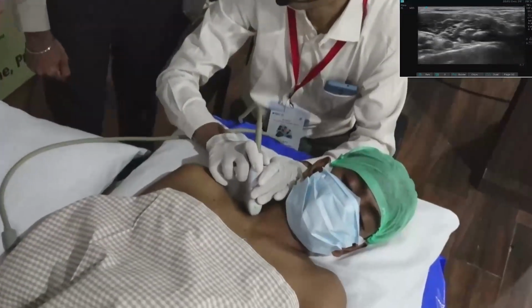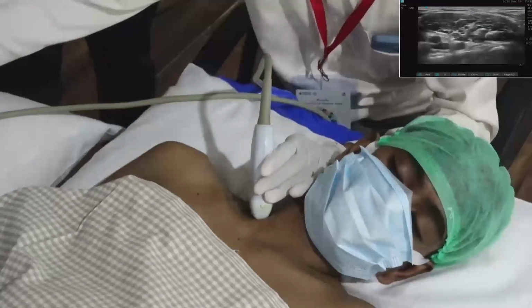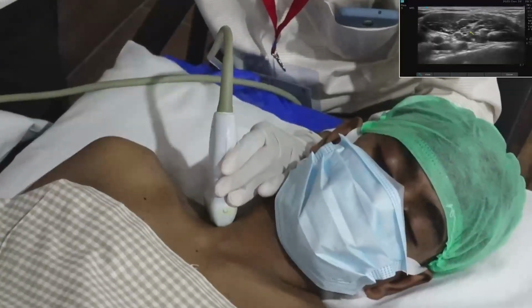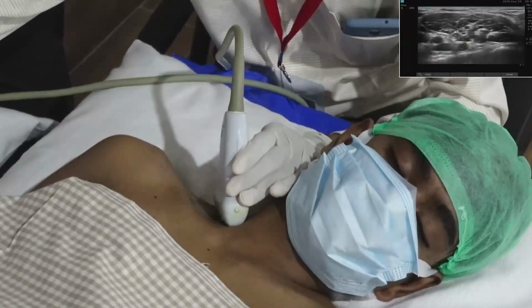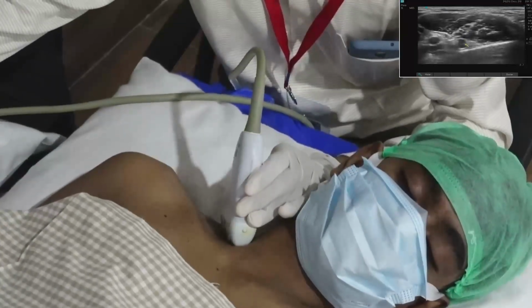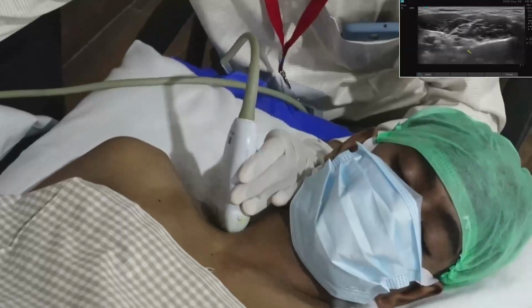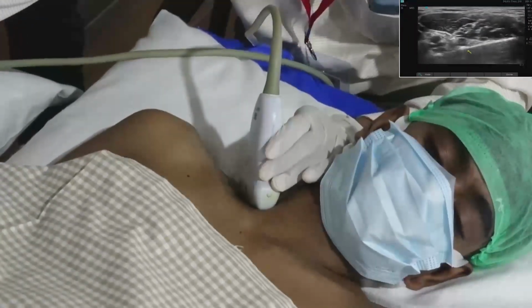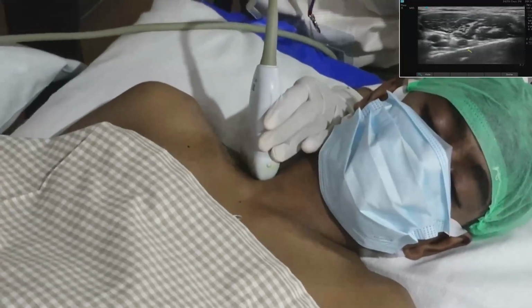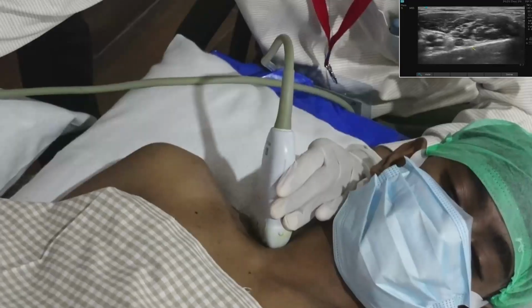Now we have to look for the distal component, that is C8. So this is middle trunk, and if you look here, one hyperechoic line, that is the first rib. In fact, they say it is the first rib and T1 transverse process bony complex, it is called the T1 transverse process and first rib complex.